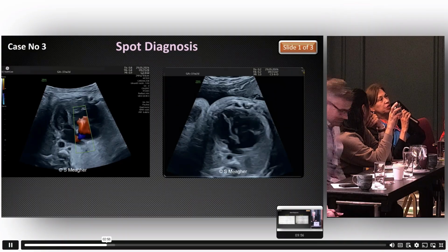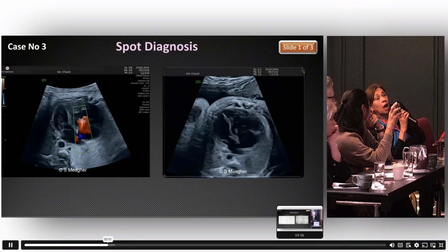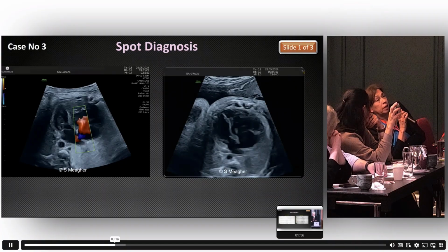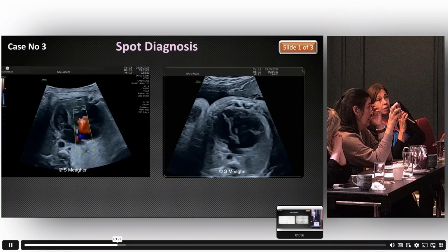That's okay. Now, if a patient is referred to me at 32 weeks and I see something that's not usual, I would always draw them two pictures of the normal heart, and I would describe to them what I can see on the scan. I would describe what I can see about the disproportion, and I would look at the aortic arch to make sure I'm happy. The scan's completely normal, Juleni. Then I would tell her that this is going to change after the baby's born, and I'll explain the physiology and pathophysiology behind that, if I'm entirely happy with the aortic arch. And I wouldn't do anything else if the arch is entirely normal.